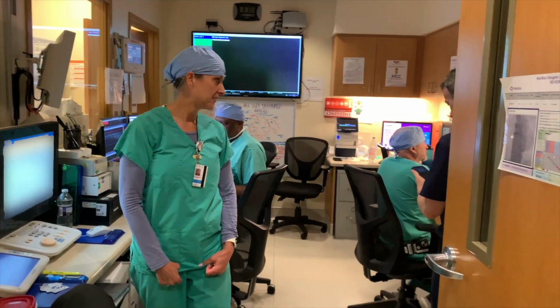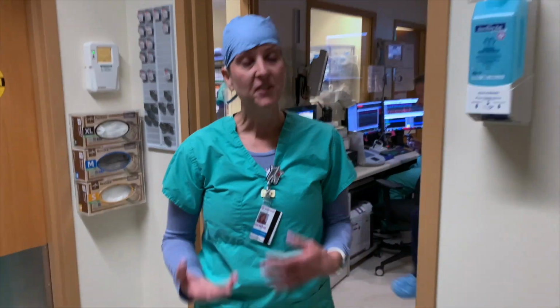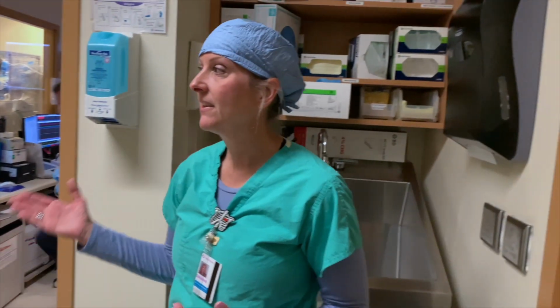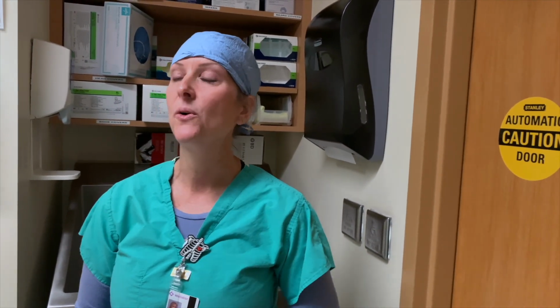So are we calling Dr. Willis? Yes. Okay. So at this point, we will switch over, and the interventional cardiologist will come in and use one of our toys, which are fun, to see what the flow is, or if we're going to fix, which means go in and put a stent in. We have something called an internal ultrasound, which takes an ultrasound picture from the inside of the artery out, so that we can see the calcium or any blockages and see what we need to do to fix it. Sometimes you still have to go to surgery, and sometimes we can do a stent. It just depends on the amount.